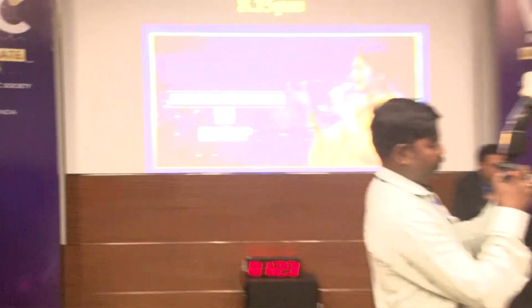But a point of contention. My understanding of this system currently is it works very poorly in complex cases and cases with osteophytes. Unlike the normal understanding, it works best in knees that are just about worn out. So it works best for doing a unicompartmental knee replacement. It works best for the unis which now have patellofemoral arthritis.